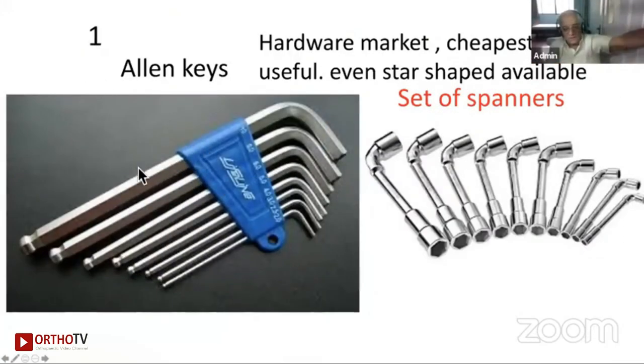I feel each one of us must have this set of Allen keys, and this set of spanners. You get them in the hardware market at the cheapest price, and again and again it has salvaged me to remove the screws, to remove the nuts and everything. I think these are very cheap. This is available in inches and in centimeters, so I think I have got both of them.